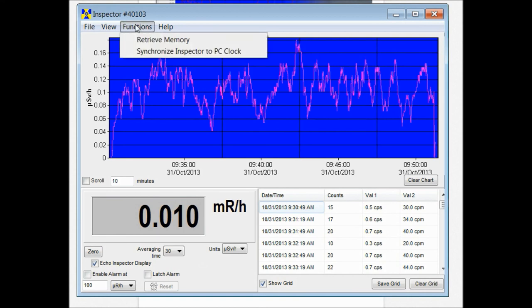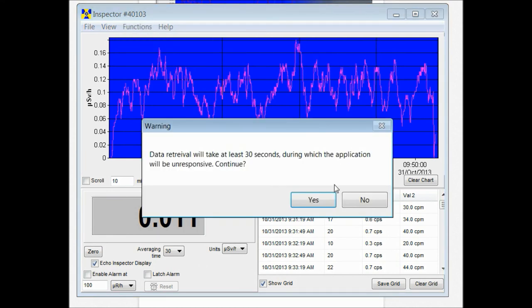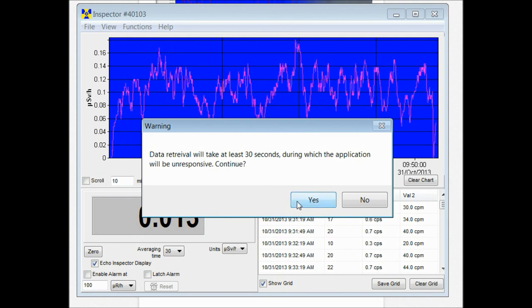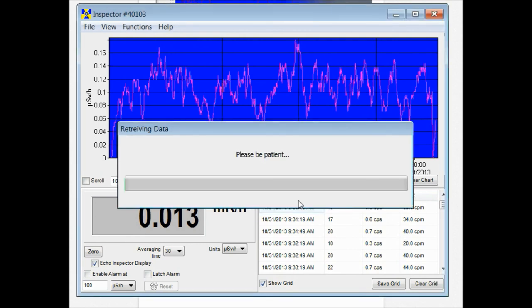After you do that you can start retrieving memory off of there. It could take up to 30 seconds. Then it starts downloading the data.